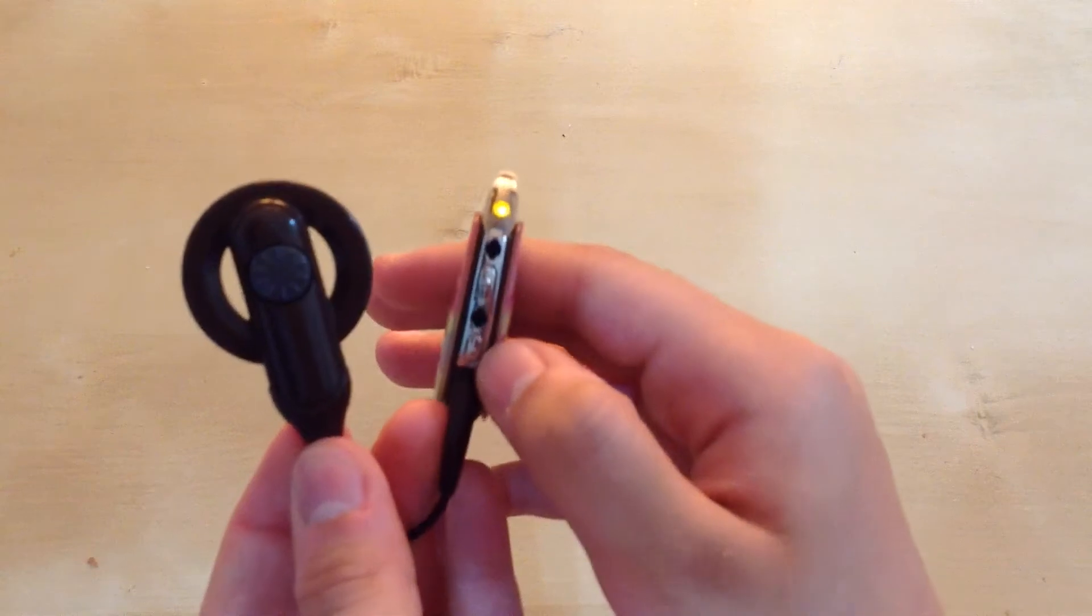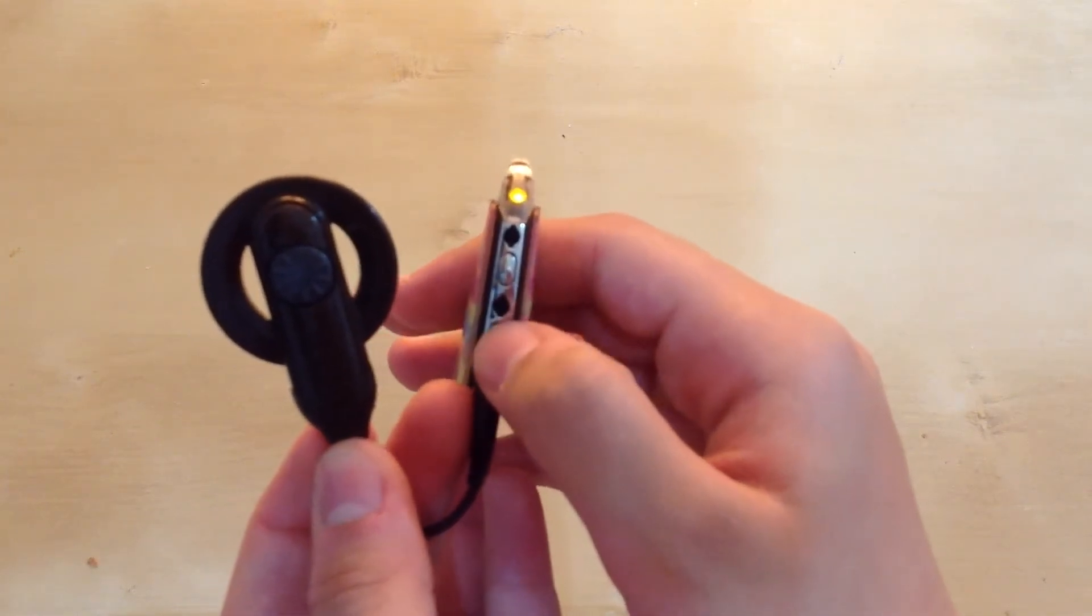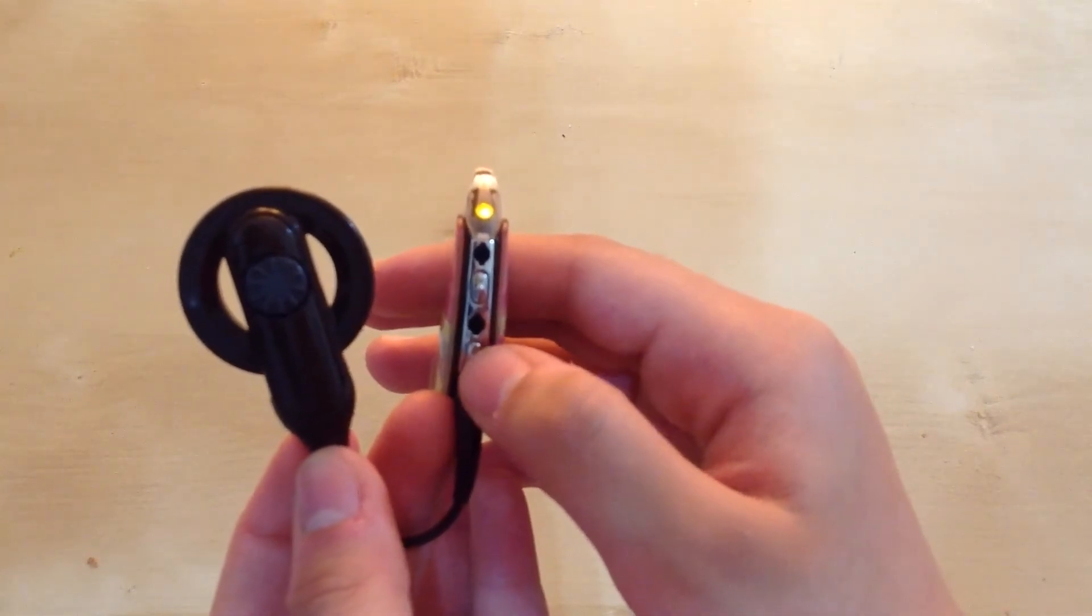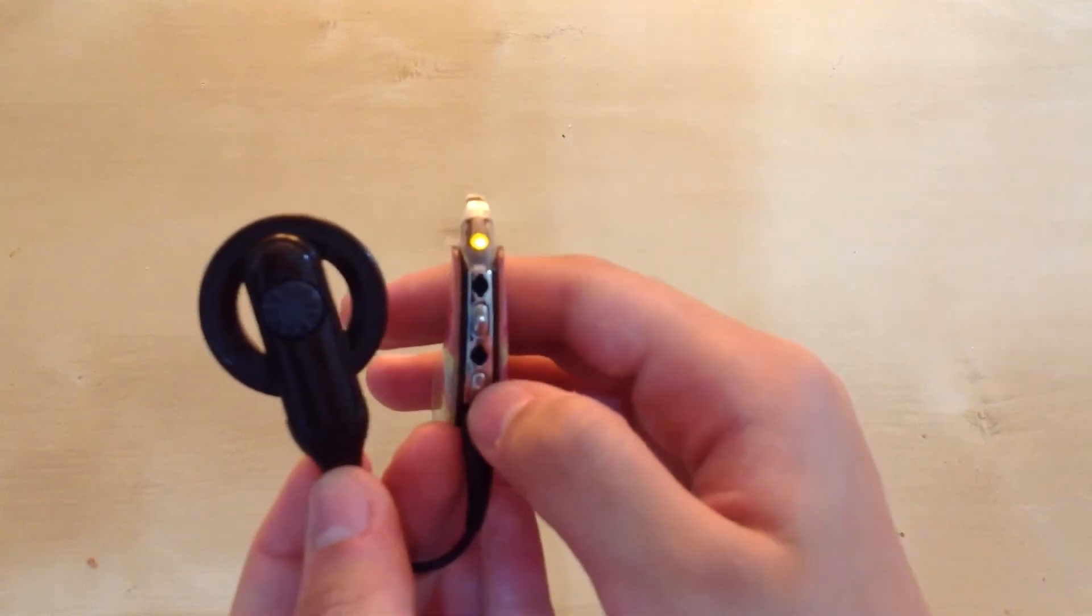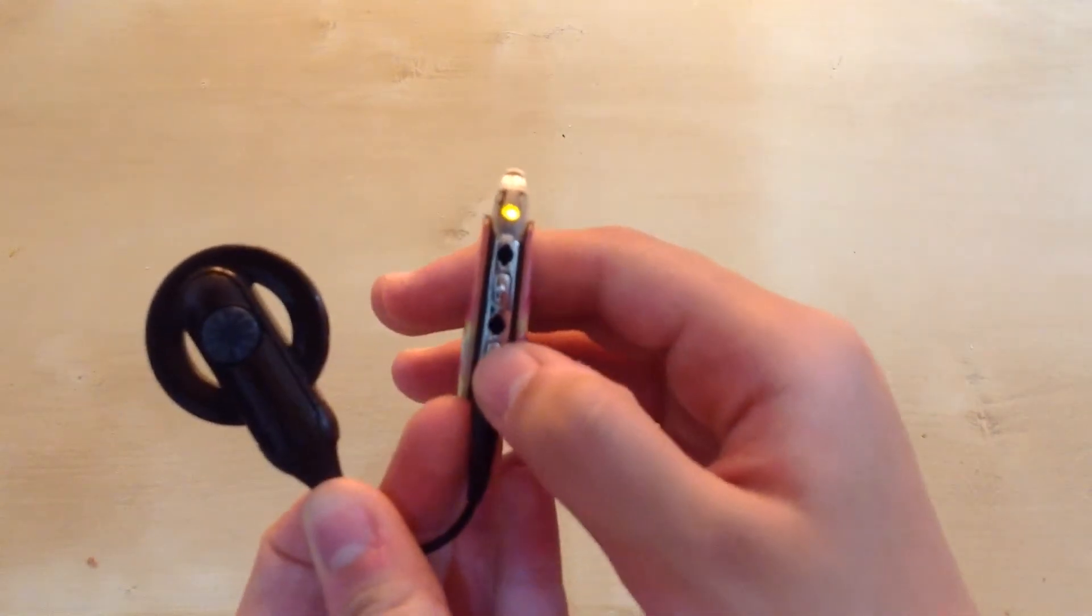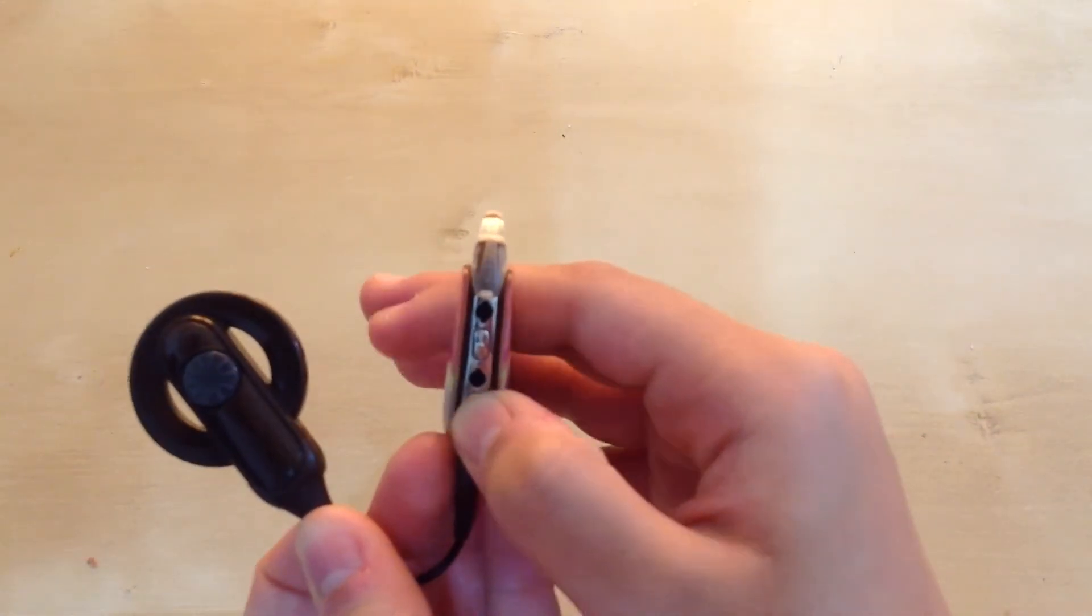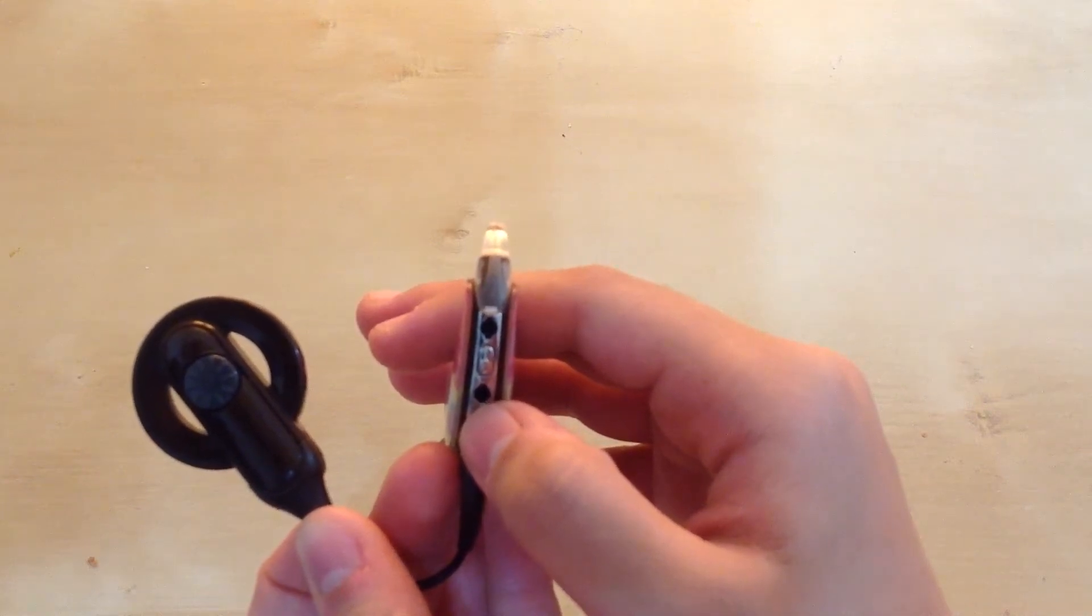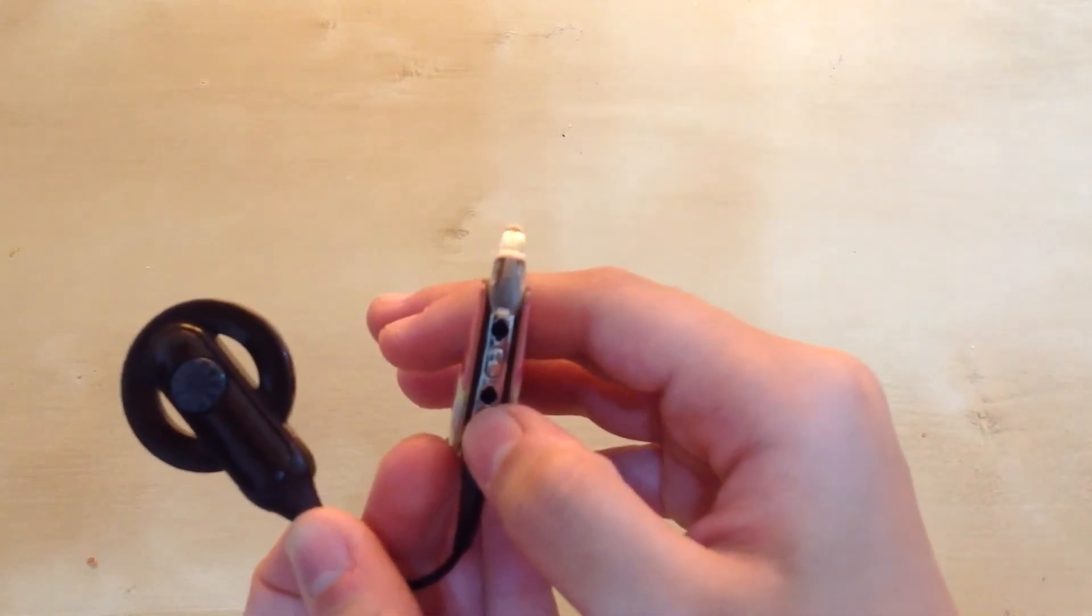Just by pressing the button quickly and letting go, not holding it for three seconds, because if I hold it for three seconds then the processor will turn off. So there were two green lights, that means it's on program two.